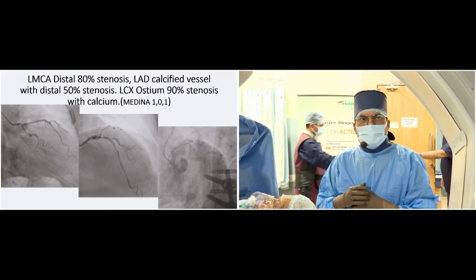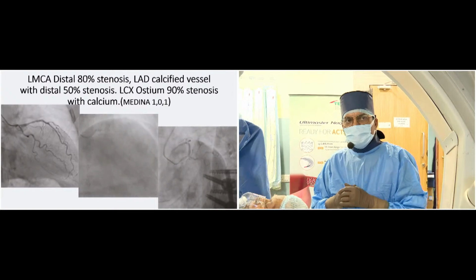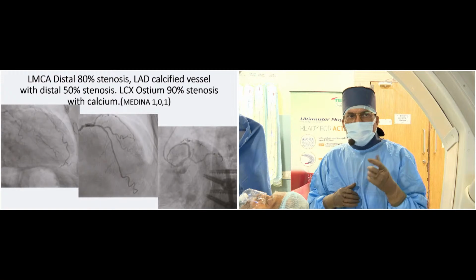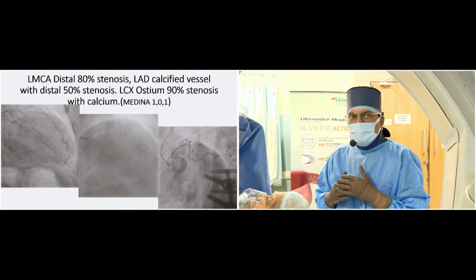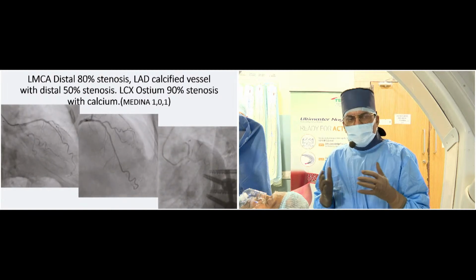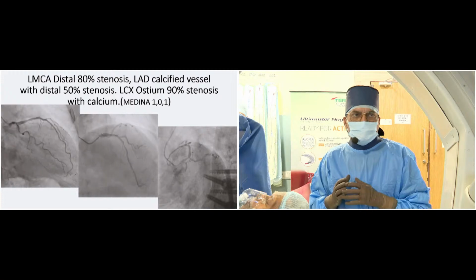And today we are happy to be launching the Ultimaster Nagomi, one of the finest stents, because I just enumerated all the salient features of this stent. Many times when you expand a stent with a bigger balloon, up to 5.5 to 6, there will be stent distortion and geometry loss.